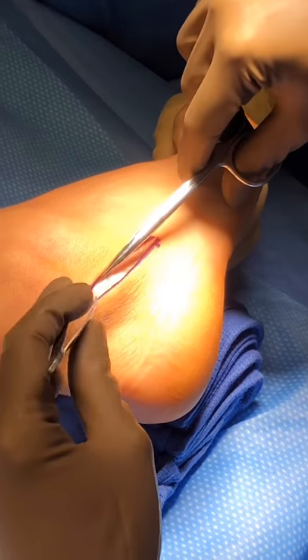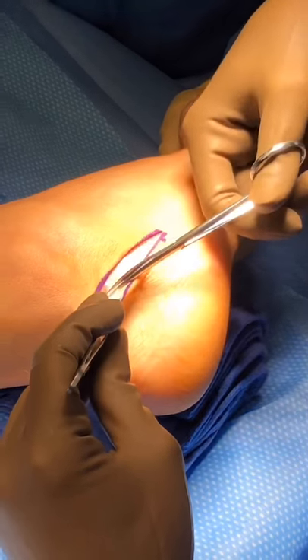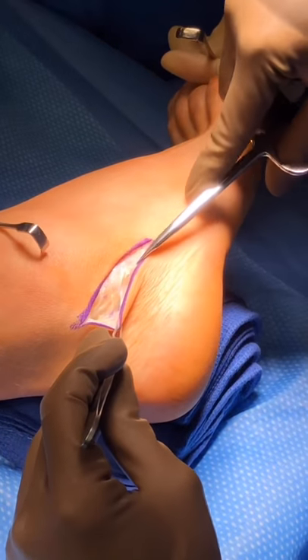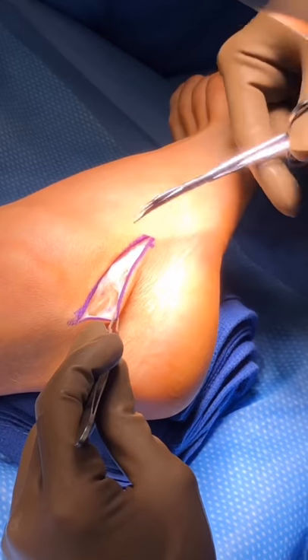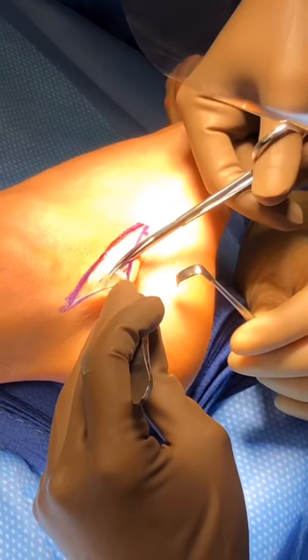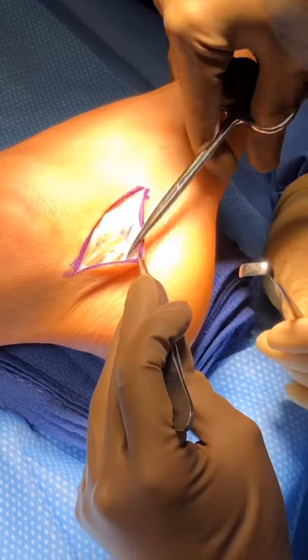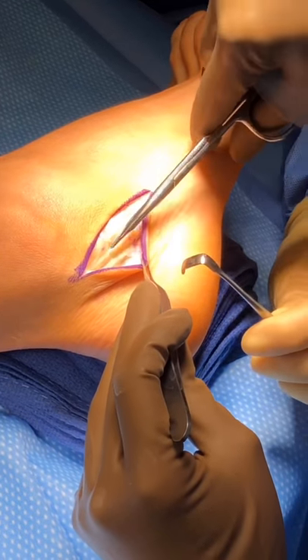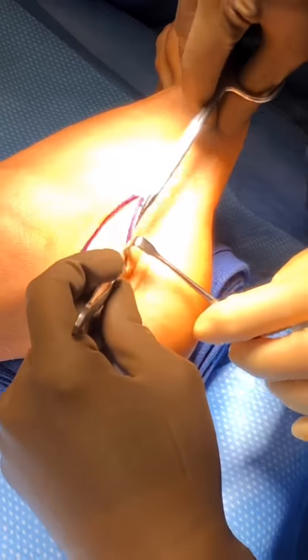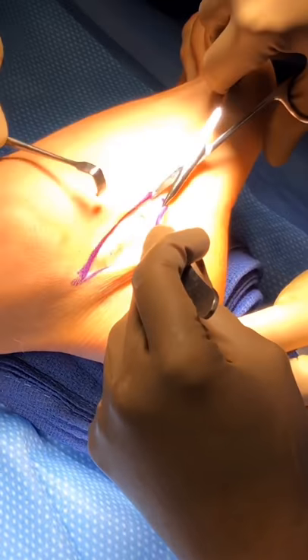There's a nerve in this region called the sural nerve, which we will protect. It is actually right here. Right here, down in here, so we'll make sure that is out of the way. See it right here? That's the sural nerve, so we'll protect that throughout the case.